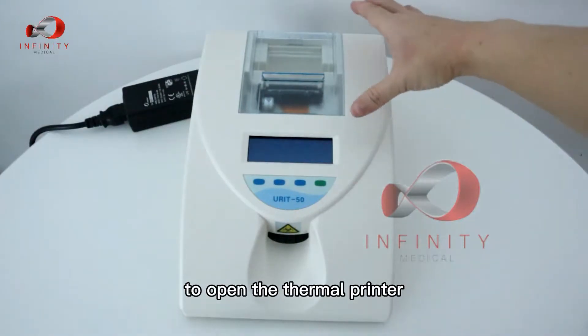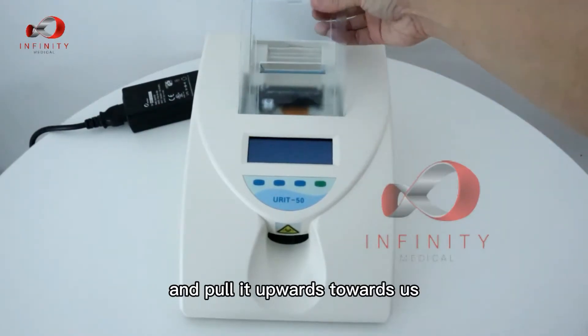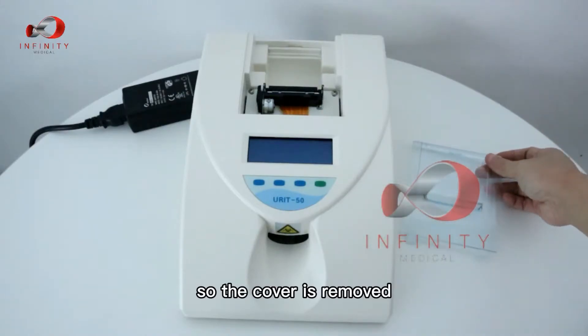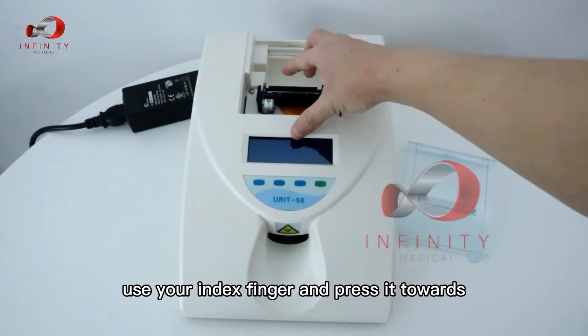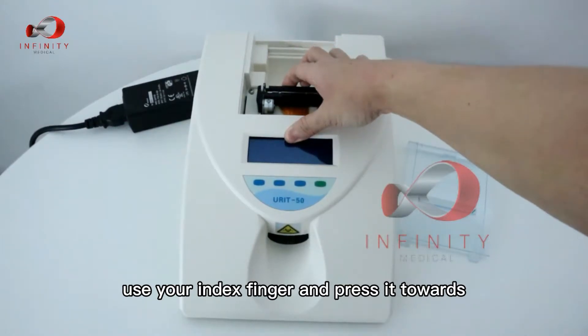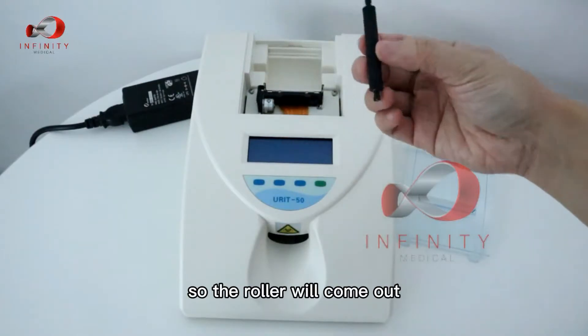To open the thermal printer, press on the latch at the back and pull it upwards and towards you. The cover is removed, then remove the roller — use your index finger and press it towards you so the roller comes out.